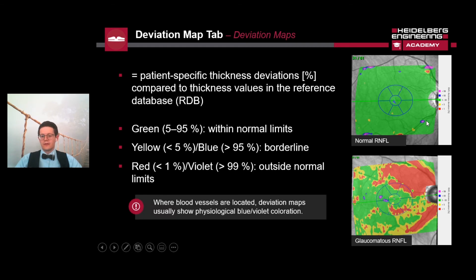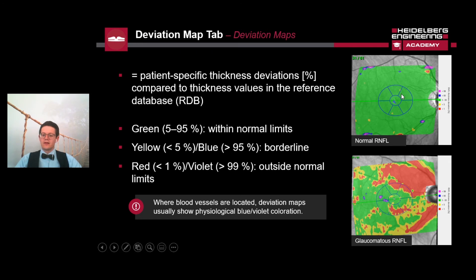Red and yellow areas represent percentile values of less than 1% and less than 5% respectively, while blue and purple areas represent percentile values of more than 95% or more than 99% respectively. Please note that it is common to see blue and purple colors due to the presence of blood vessels. Green areas represent percentile values between 5 and 95%, which we would call normal values.